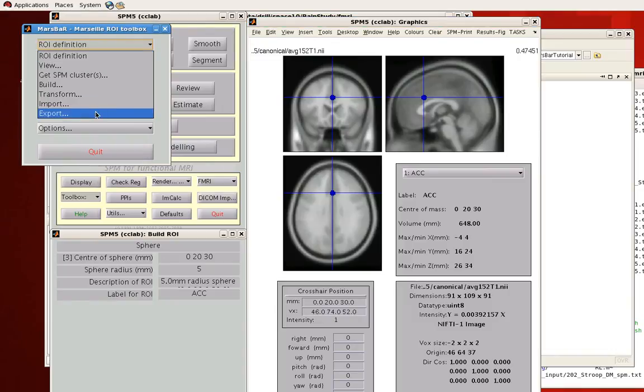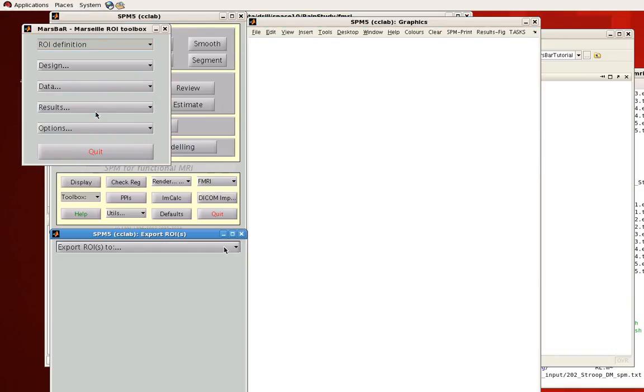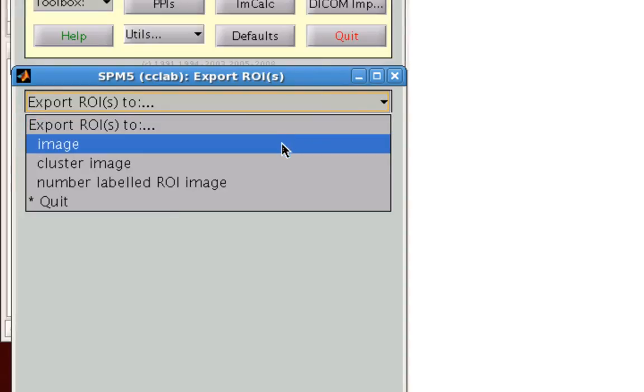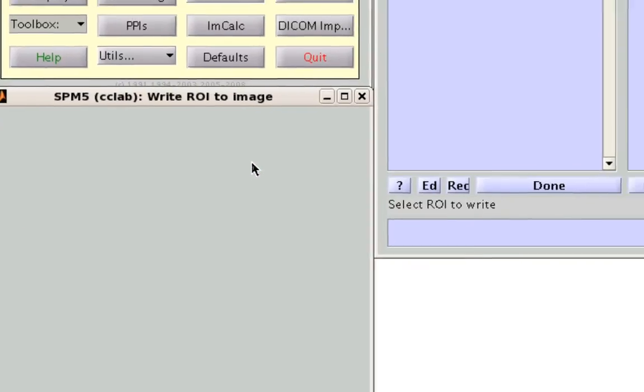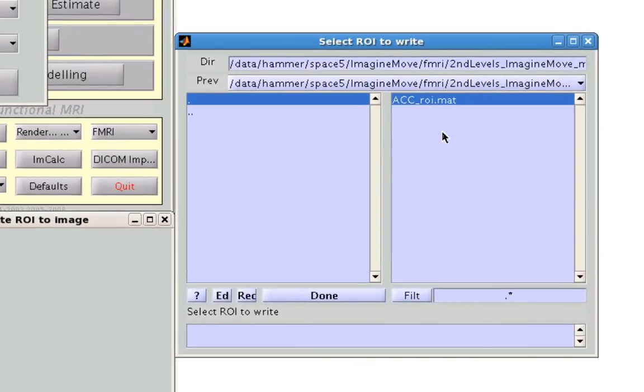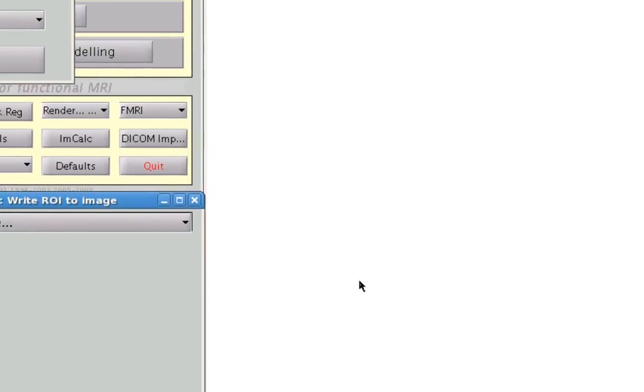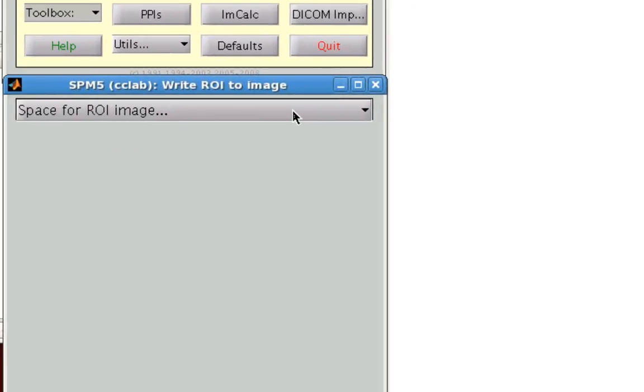Lastly, you can go ahead and export this and make sure that it is converted to an image which has a nifty extension, which can then be used across other programs. So go ahead, click that. Select this recently created ROI again, the .mat file. Click Done.